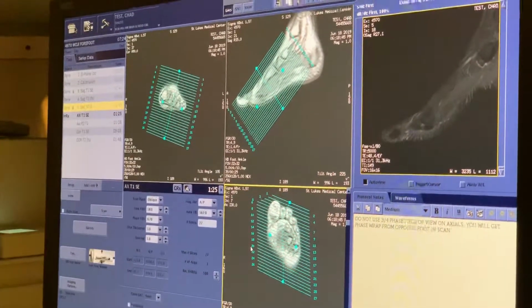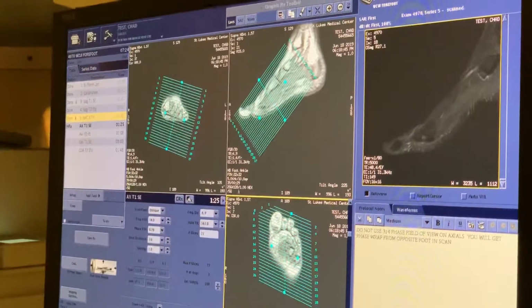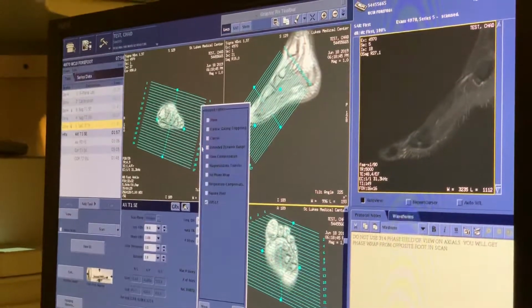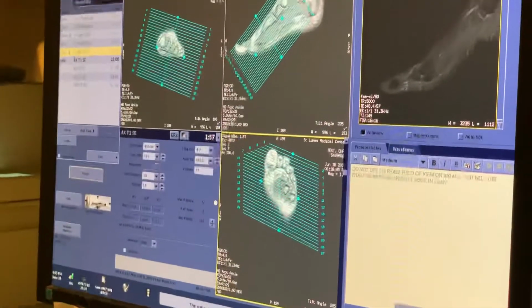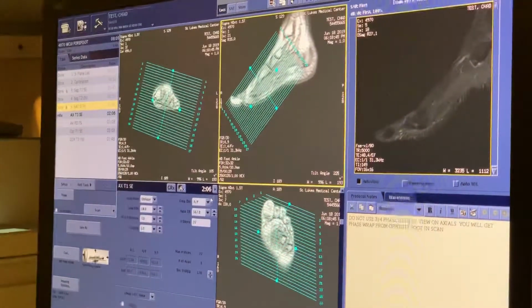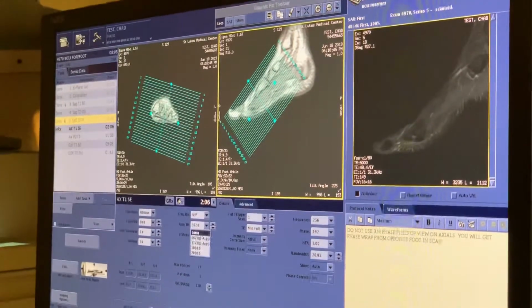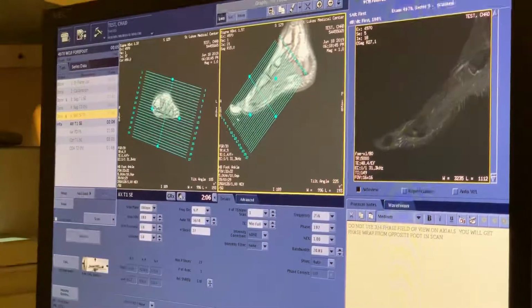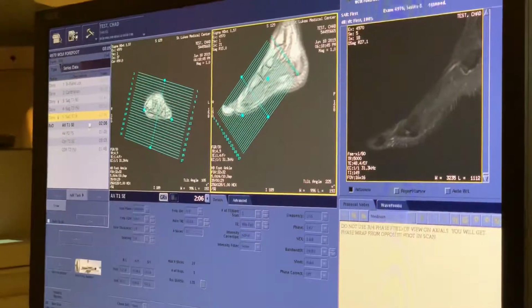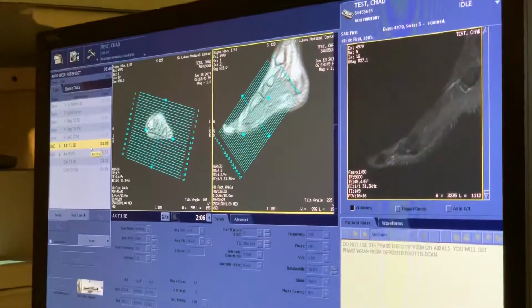If you shove their foot all the way over as far as you can, it might not give you any signal, but it still might. So to be safe, what you can do is you can go here and then you can put a no phase wrap on here. And that's going to make certain that you don't have that problem. All right, so 256, 192, 1. All right, that's TR, looks good. Make sure that my slices are going from superior to inferior, and they are, so I can save it. Okay, this next scan is about 2.5 minutes.